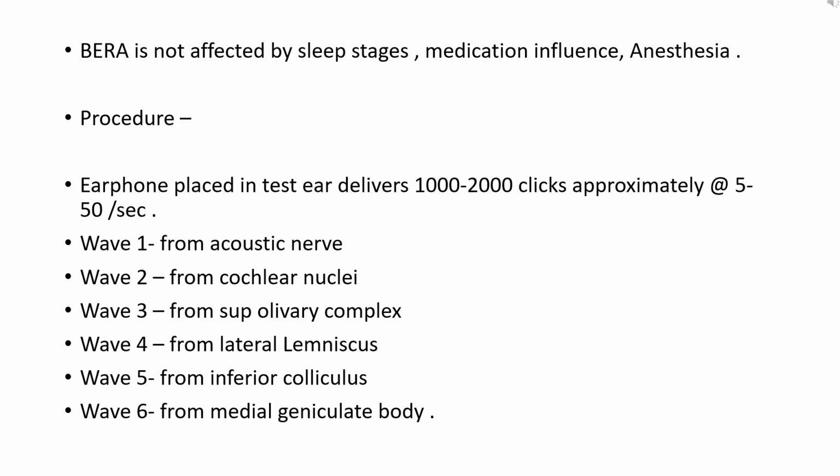So what are the advantages of BERA? BERA is not affected by the sleep stages and any kind of medication influence or presence of general anesthesia. So these are the few advantages that reduce its limitation over the conventional tests such as pure tone audiogram and others. So now coming to the procedure, how we will perform the BERA.